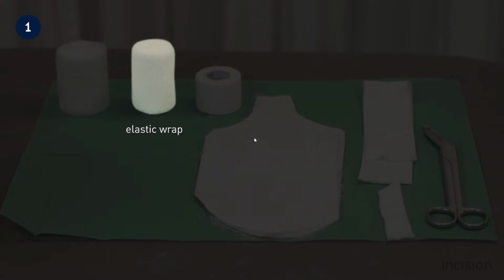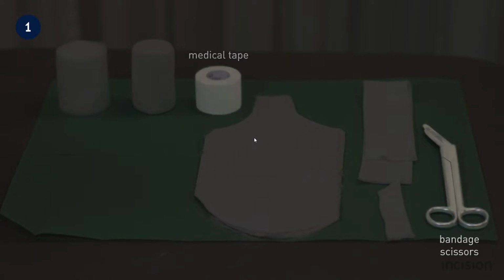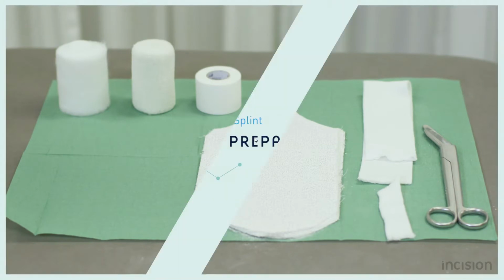An elastic wrap with a width of 7.5 centimeters. Medical tape. And bandage scissors. Do note that the size of the materials used depends on the size of the patient.